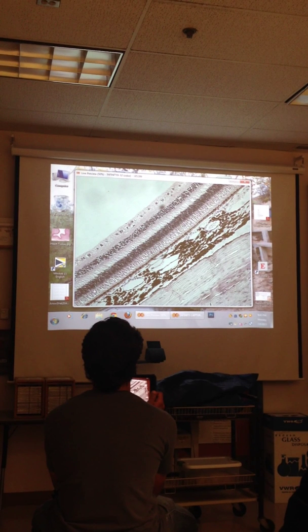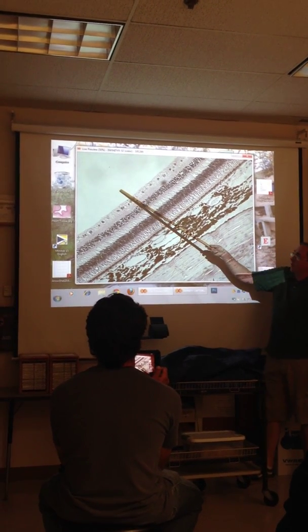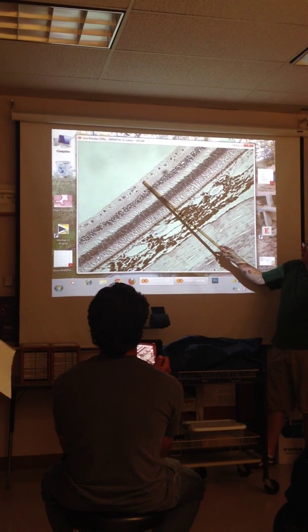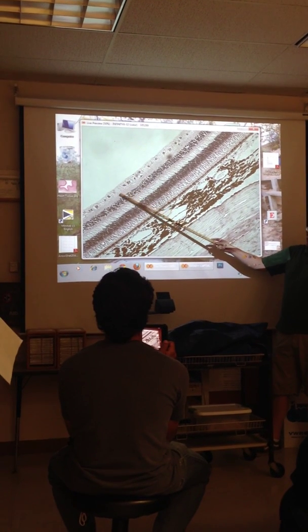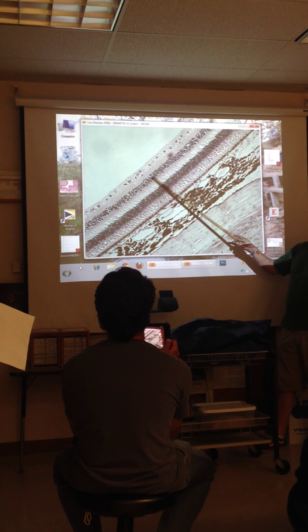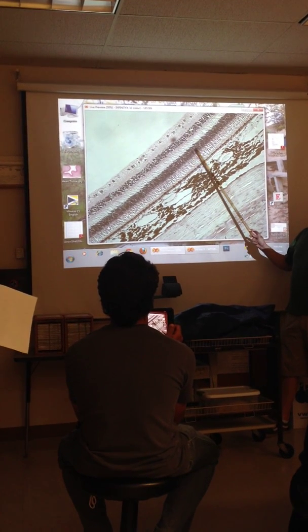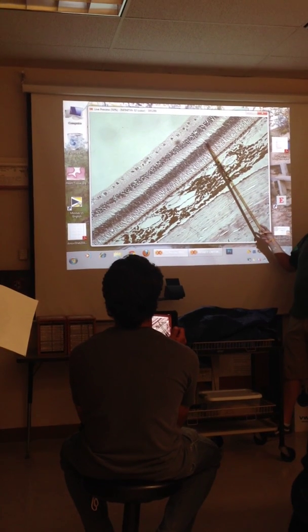So again, starting from here's your posterior cavity, this is where the light's coming in, right? And the light goes past the first two layers of cells. So the first layer of cells, all these big nuclei that are pretty spread out, what were those again? Those are the ganglion. Then the first thick-looking layer of nuclei, that's bipolar cells. And these are the rods and cones in the back, the photoreceptor cells, all of this right here.